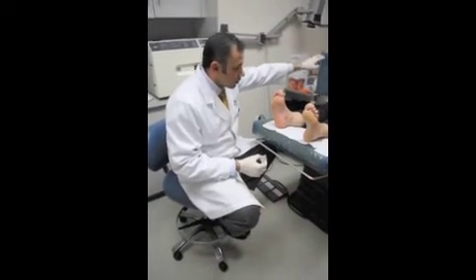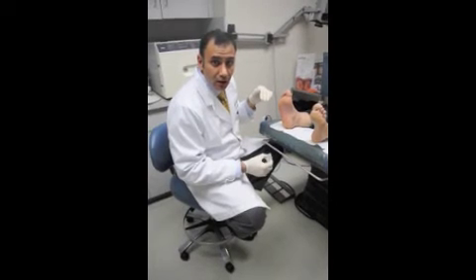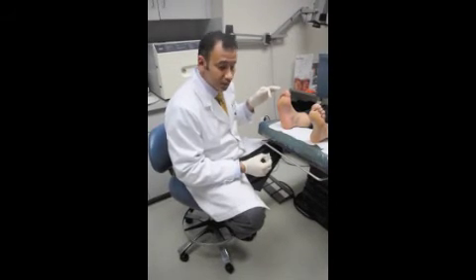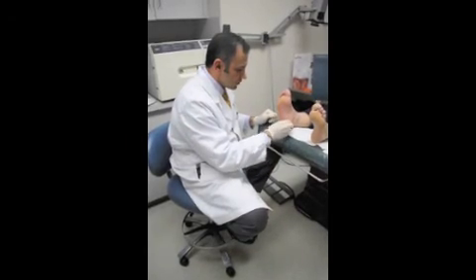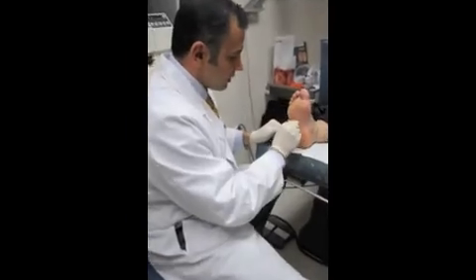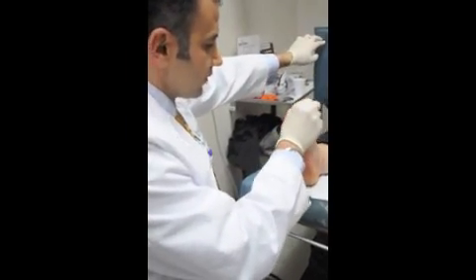We're done with our 100 units — we've given four cc's of the Botox solution. Just before the patient leaves, sometimes we just ice the area; that helps minimize the bruising. You could have some bruising from this.